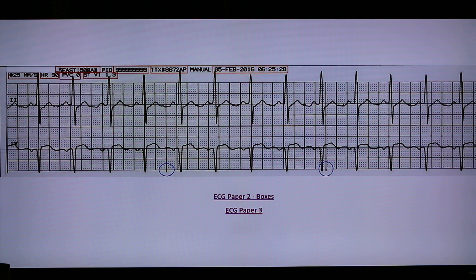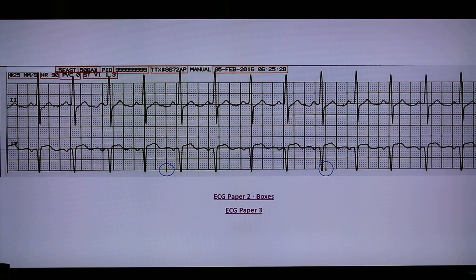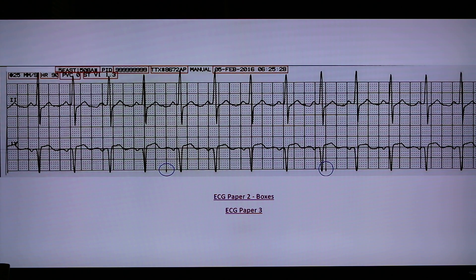The EKG paper also has information like the patient's name, the telemetry floor, the room or bed number, the patient ID or medical records number, the telebox number, and the date and time. On the second line will be the paper speed, which is usually 25 mm per second, the heart rate, the PVC count, and ST segment analysis.